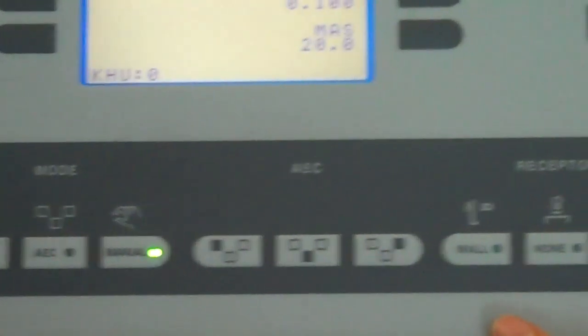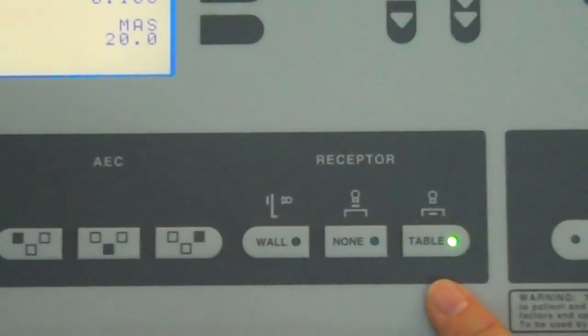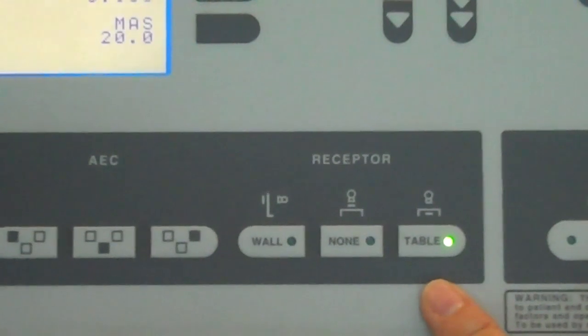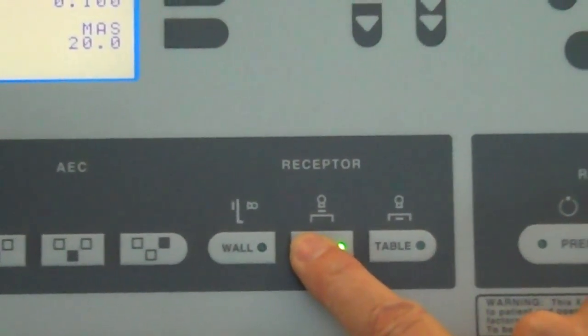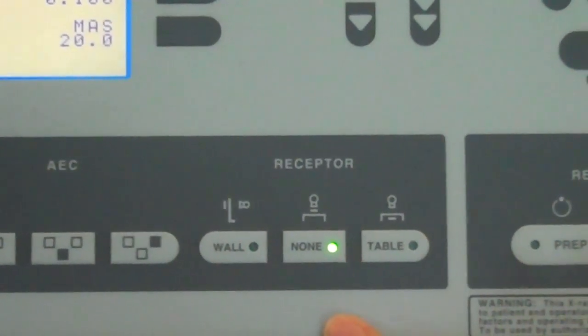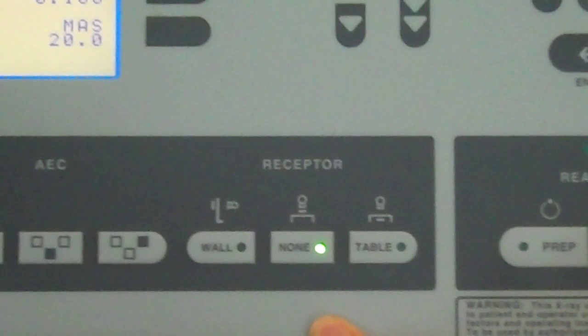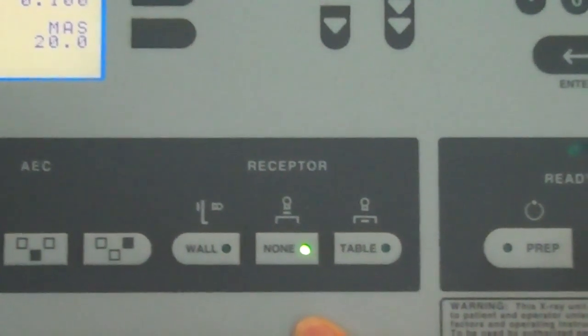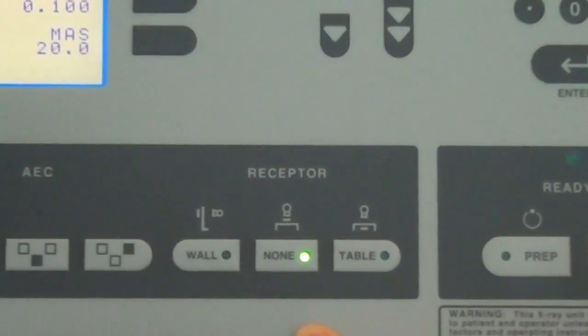Also, as you move across, you'll come to the receptor. We're going to select none as we're going to do a tube warm up and we will not have an image receptor in the table bucky or in the room.